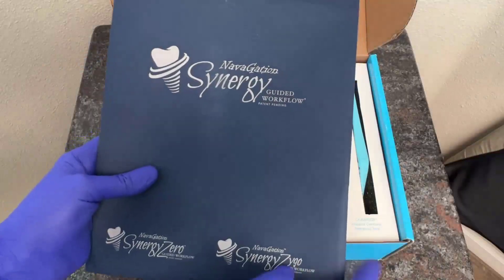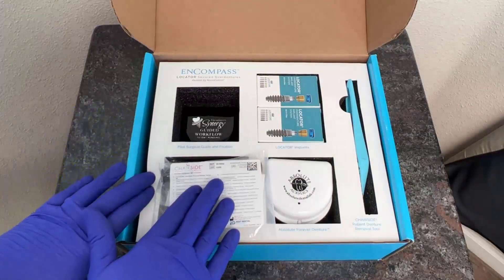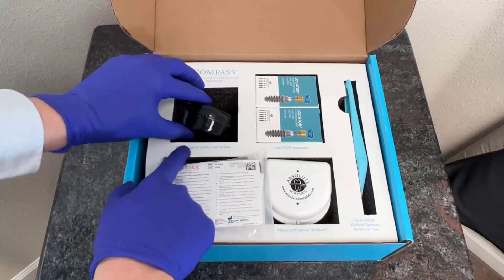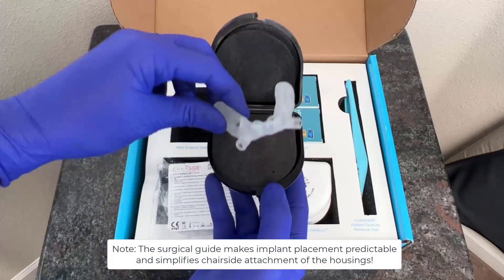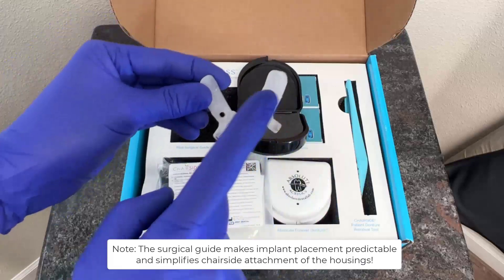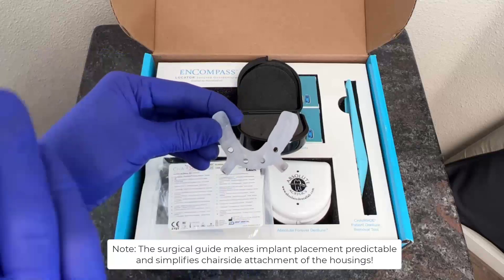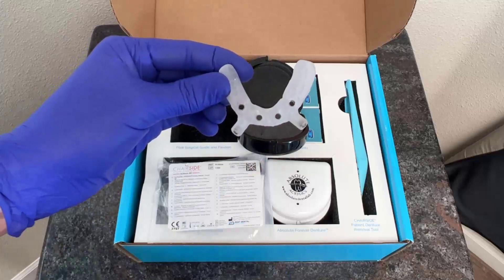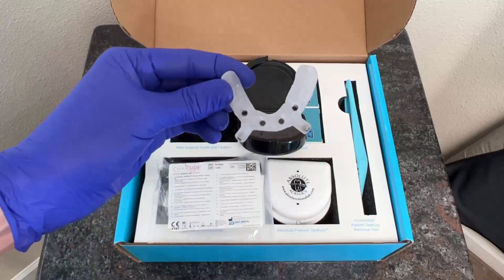Once we've taken a look at the information contents in our pamphlets, we can go ahead and put that to the side and take a look at the actual contents of our box. Starting here at the top left, we have our pilot surgical guide and fixation. Opening up our box, we can see here we have our 3D printed surgical guide. The 3D printed surgical guide matches the treatment plan that was in our pamphlet of information put together by our Navigation Synergy team. We have our four guide tubes, which will allow us to go ahead and work surgically with our pilot guide for our LODI or Locator Overdenture Implant System.